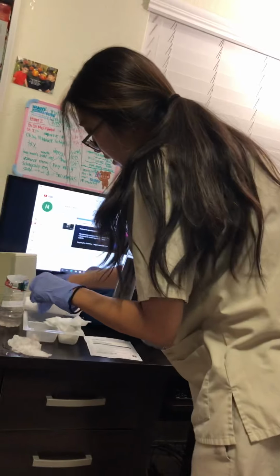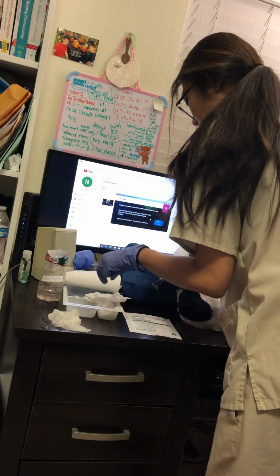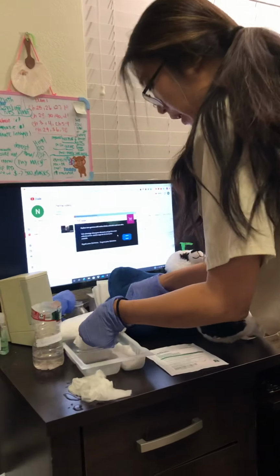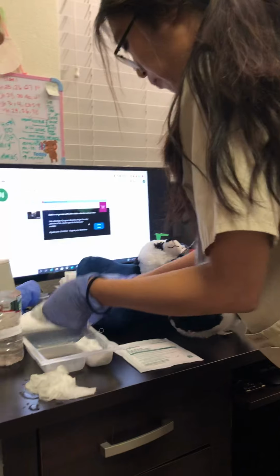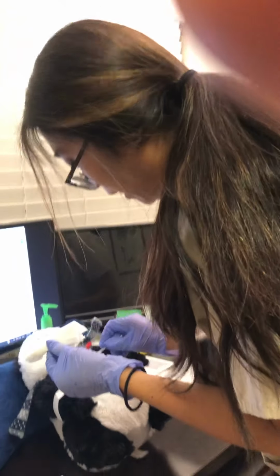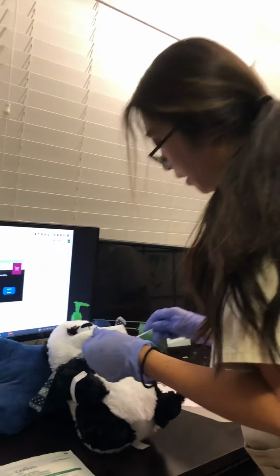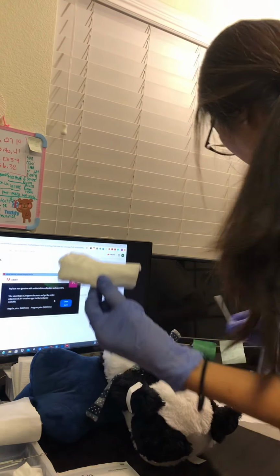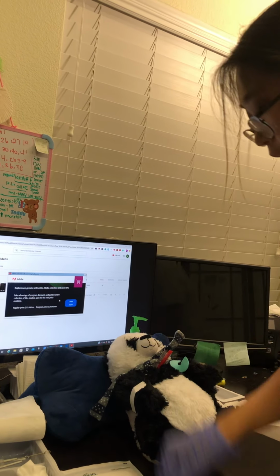Then I have all these things set up already and ready. So this, let's say that this has already been soaked, and the Q-tips as well. We would then clean around this area. Okay, I just improvised and cleaned under the area and around. Okay, and over the area. You can use two Q-tips about, and I would discard of that.